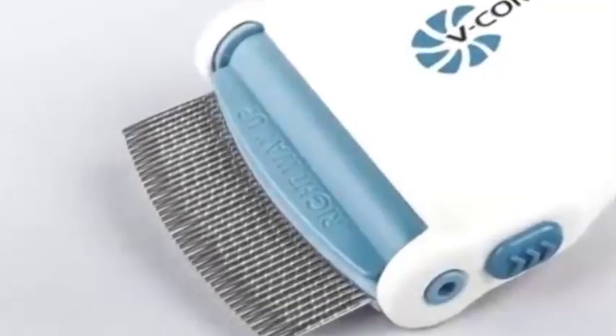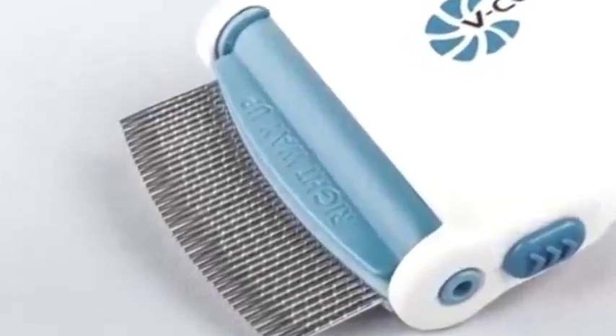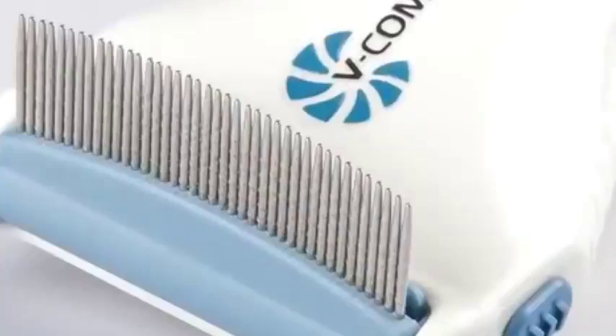The combing unit features stainless steel teeth with gentle rounded edges and two adjustable combing angles, allowing for comfort and ease of use without damaging the hair.